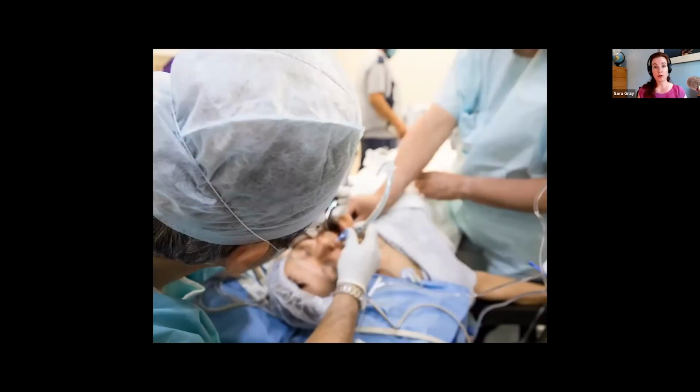We do all of those components regularly, but I want to mention 2 things here that we don't do as commonly. When I'm thinking about extubating somebody in the emergency department, the next thing I think about is, do they have a cuff leak? And what that means is, when I deflate the balloon or the cuff around their endotracheal tube, can I hear air leaking around it? And you want to hear that, right? And I'm going to tell you why in just a sec. But the way you do this is you deflate the cuff, and then you occlude the tip of their endotracheal tube and see if you can just hear a whoosh of air.